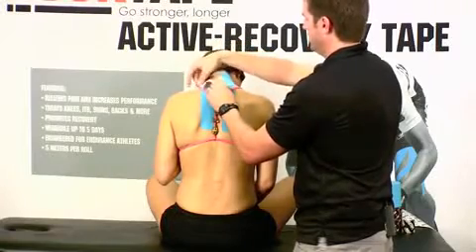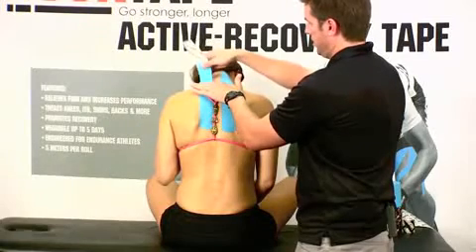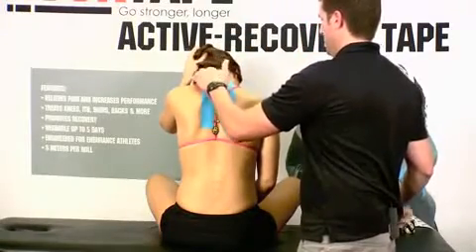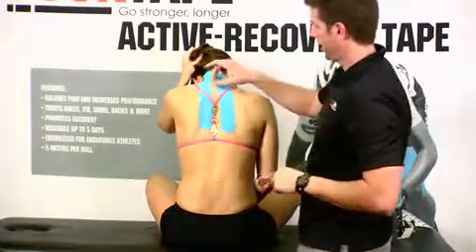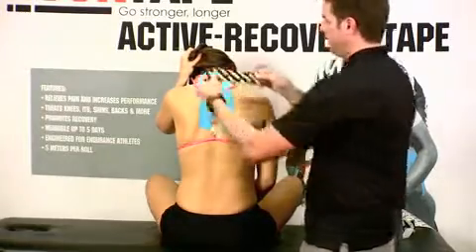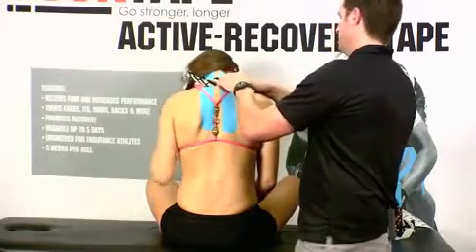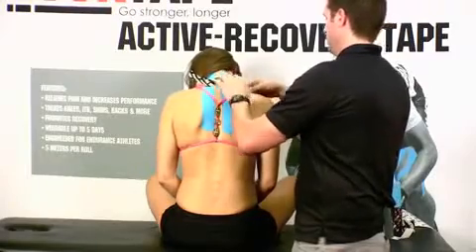As I lay this down, I'm just going to pull this backing out. Go ahead and pull your hair right up. Lay this down coming right up here at the base of the neck. The pain is going right around that T1 region. Decompression strip — I'm going to tear right in the center, with a 50 percent pull going right across that spot. Go ahead and lay those ends down with no tension on the ends of the tape, especially in that neck region.